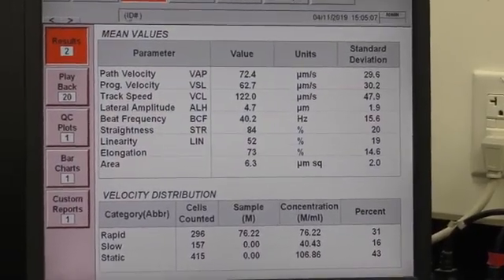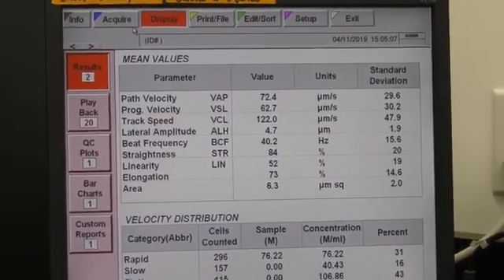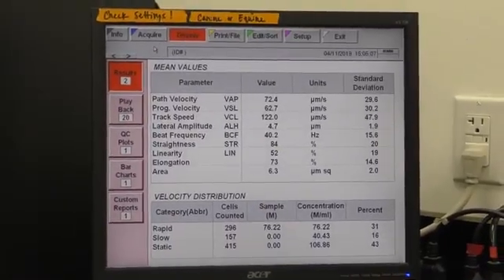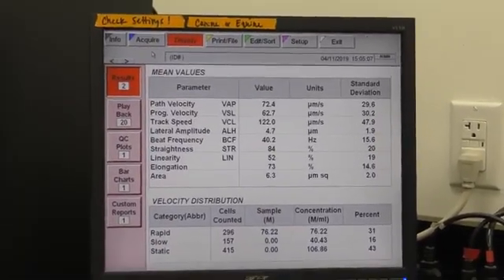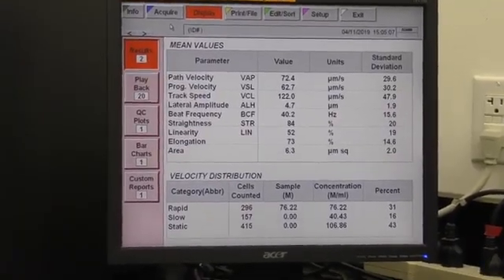We hear people talking about semen, and they say one number for motility. How do we know if that's total or progressive? And what does that mean for us? What's the important number to know? The really important number is progressive motility.